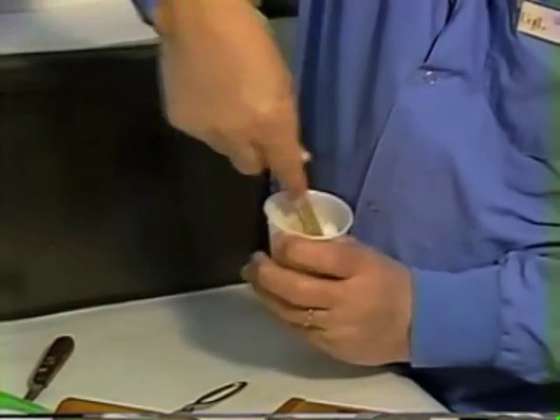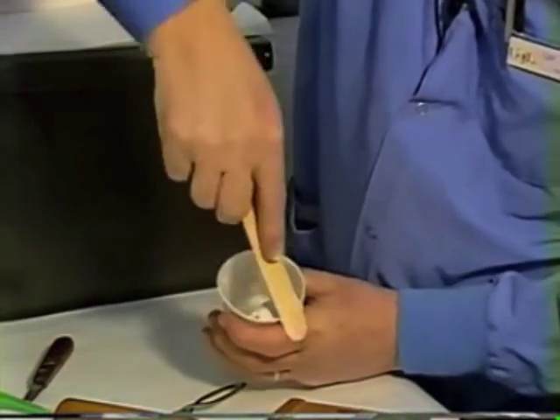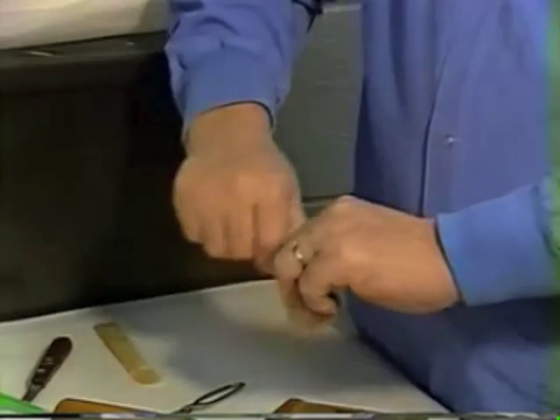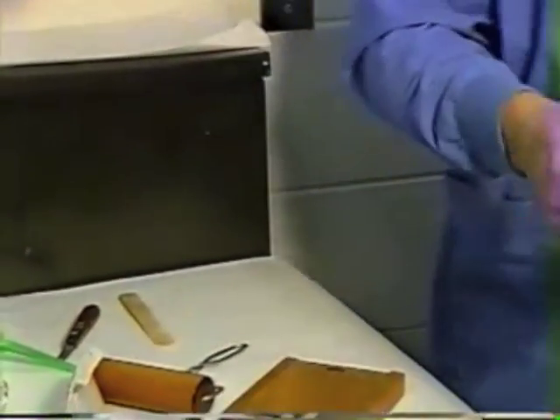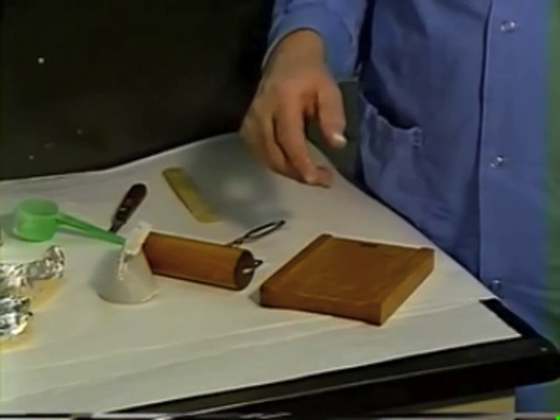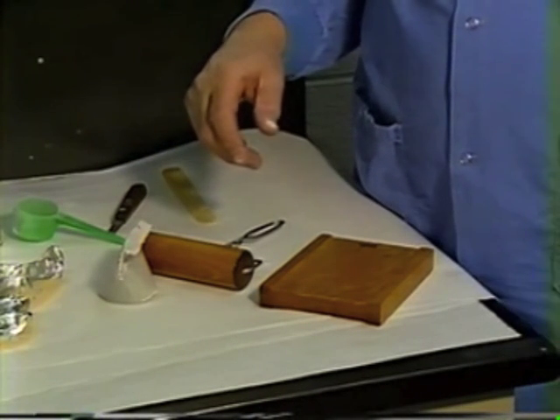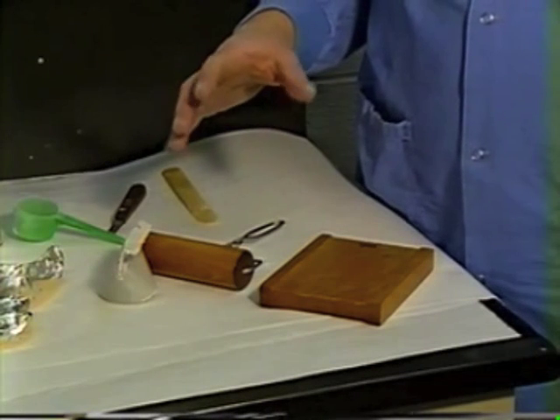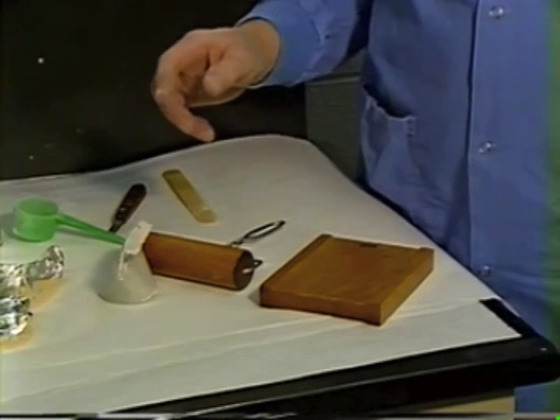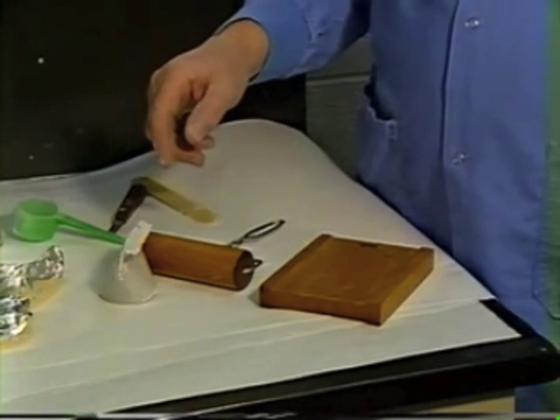Once you get it to a nice little wetted mass with no dry powder, pinch the top of the cup and just leave it sitting for about 20 to 25 seconds to allow the material to start reaching what is known as a gel state. The material goes through a wetted state, then into a gel state, and from the gel state it will polymerize into a hardened material. The state at which you can work with the material is the gel state.